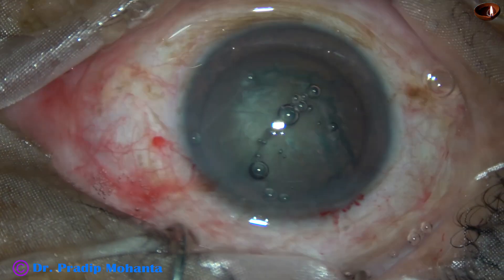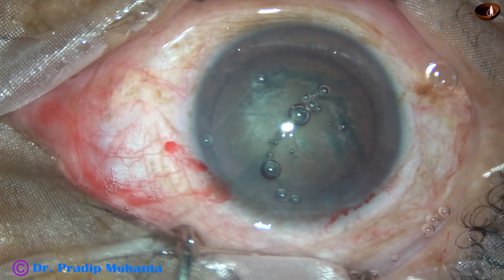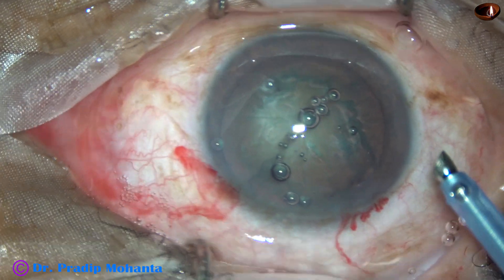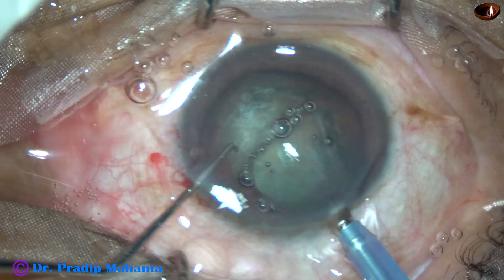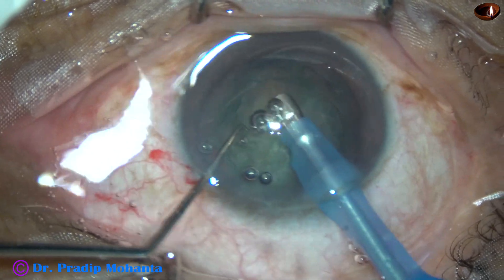Now we are going to introduce the phaco probe — that is the phaco needle. The exposed part of the phaco needle in such cases is not much. In this case the exposed part is a little more, but we can decrease the exposed part of the phaco needle in such cases.